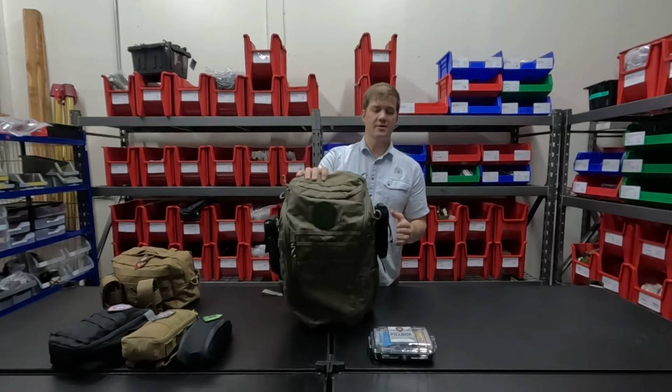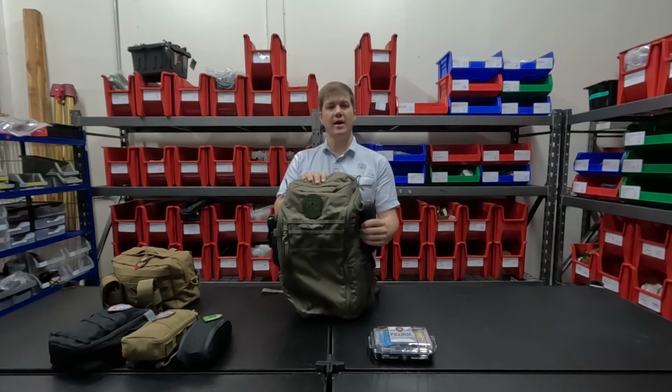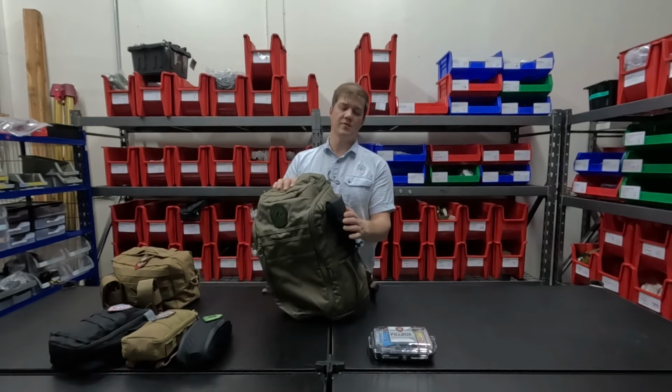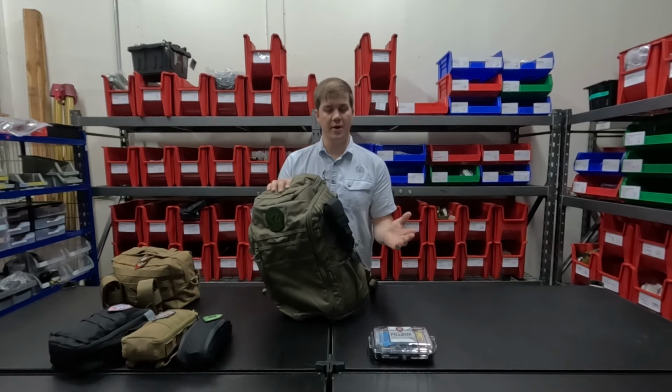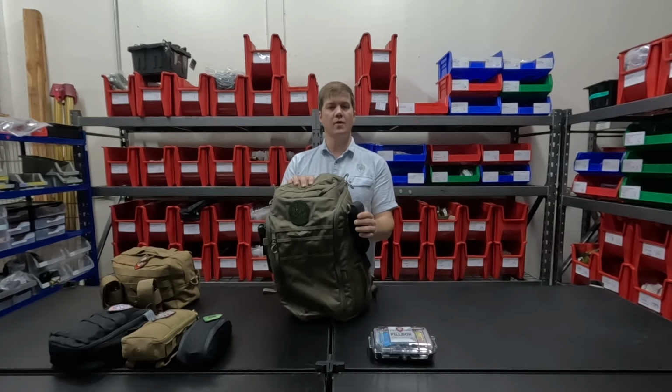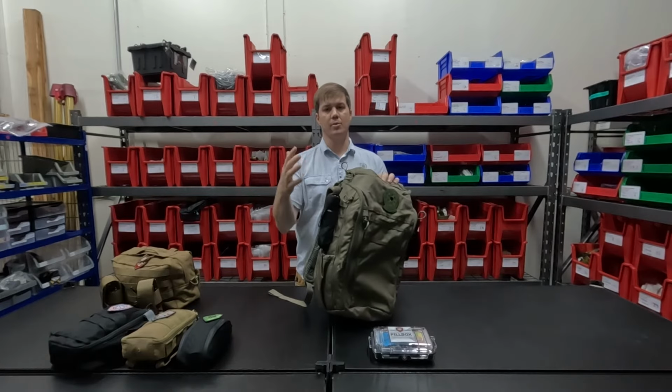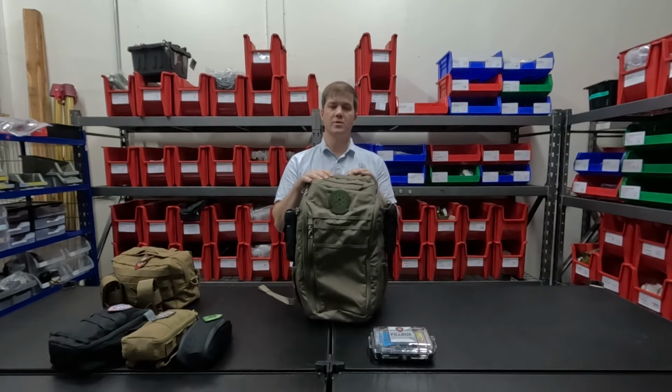Let's go through the bag itself. On the outside, you'll see we've got 2 components here. We usually put these in similar colors. These are just different for us to be able to see them a little bit easier in the video here today, but easy to get to. On the outside are 2 tourniquets in holsters here, 1 on each side for us to deploy those pretty quickly as we roll into a scene.